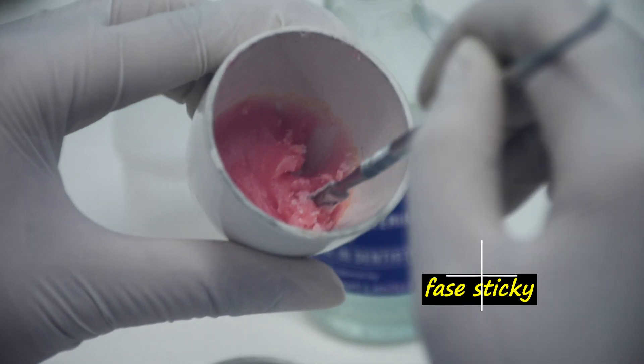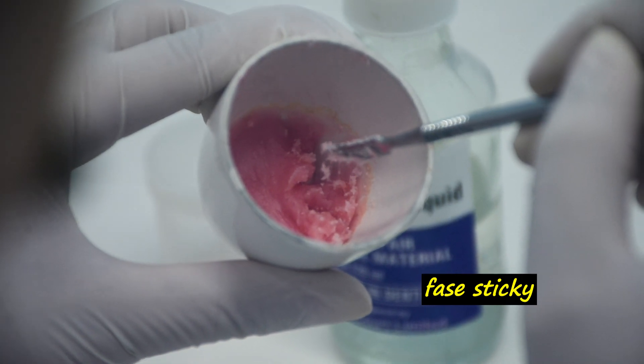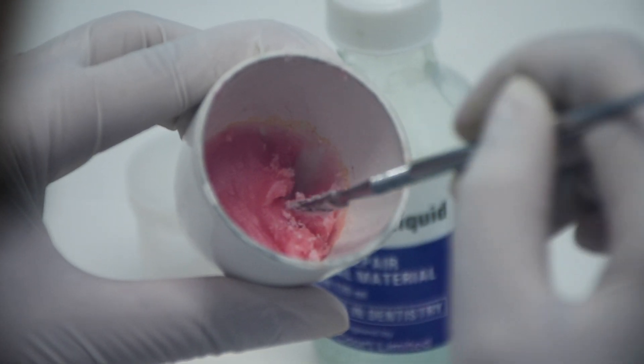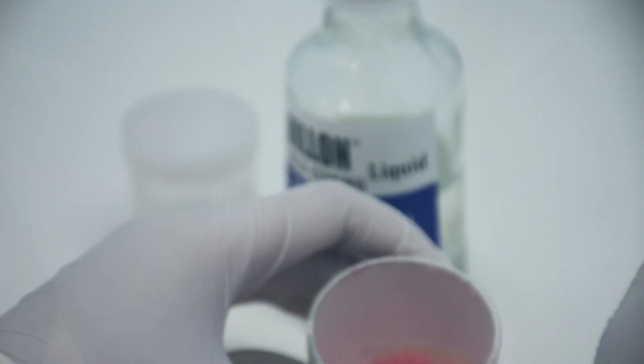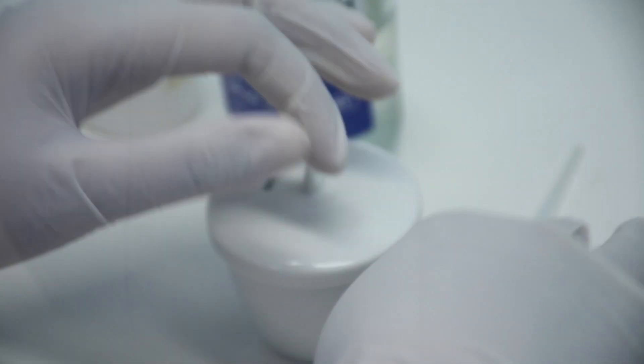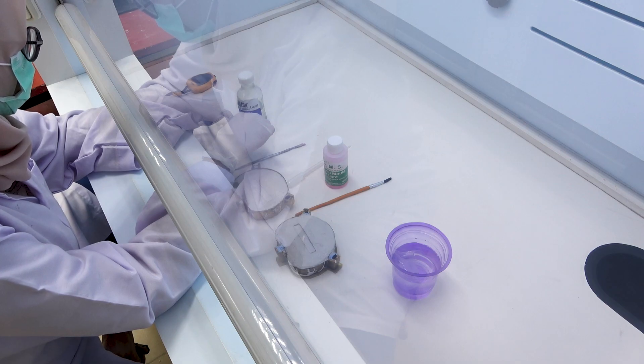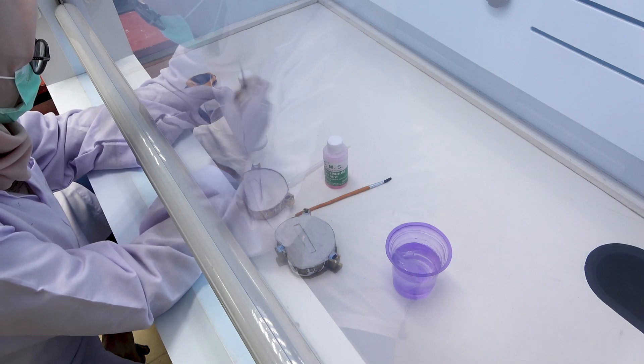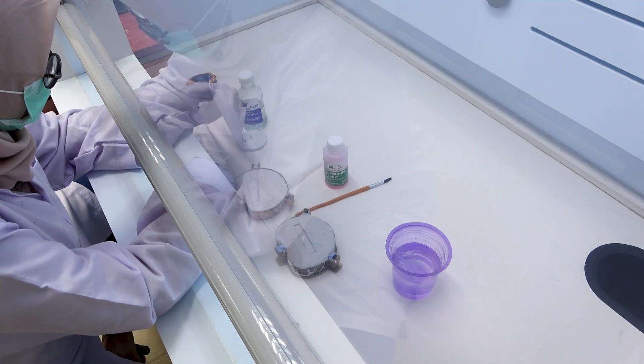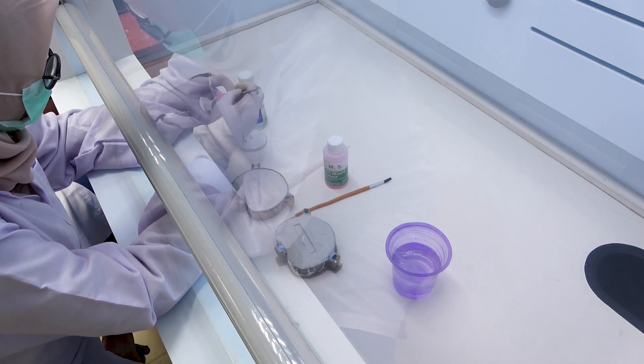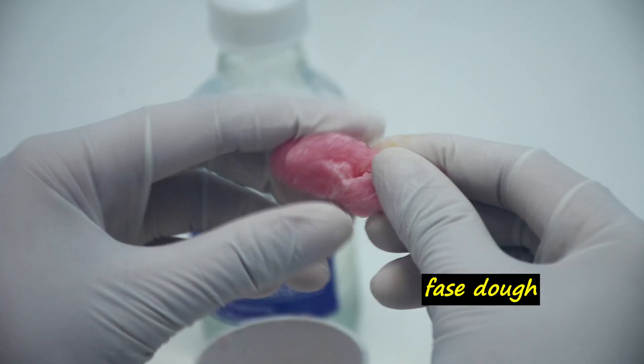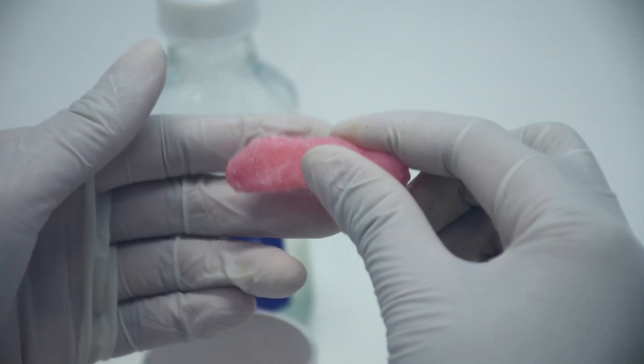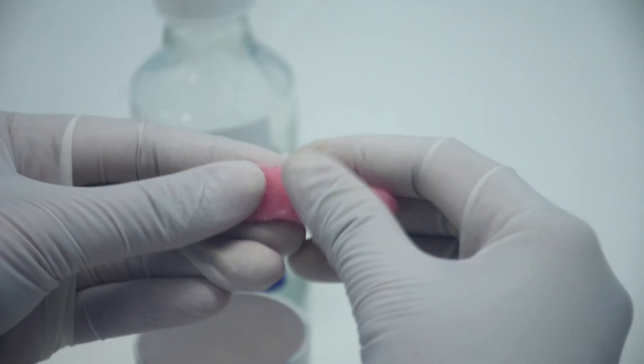If the dough phase hasn't been reached, close the dappen dish again. Note that if the resin mixture has passed the dough phase into the rubbery phase, the resin mixture can no longer be used.